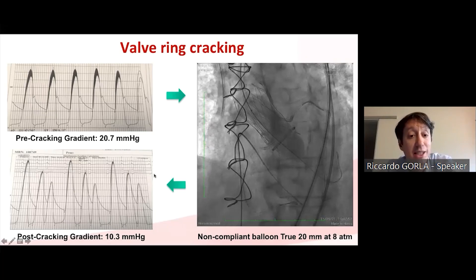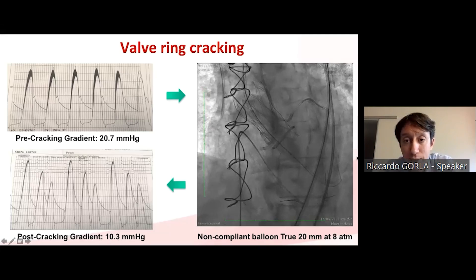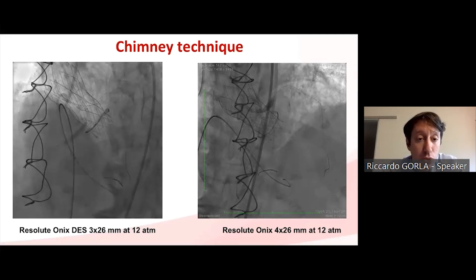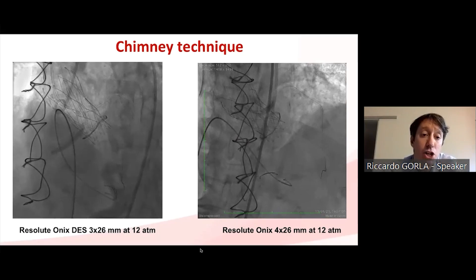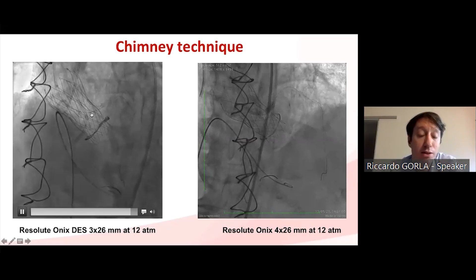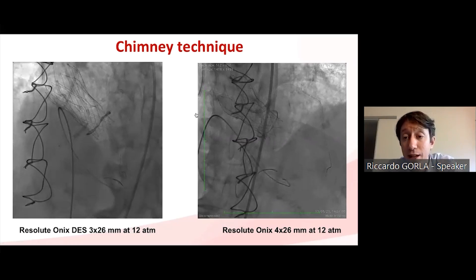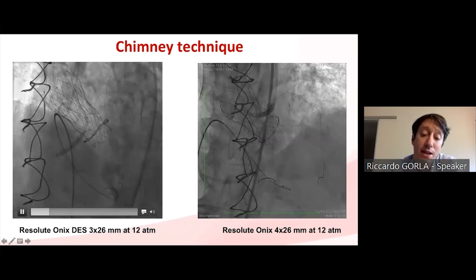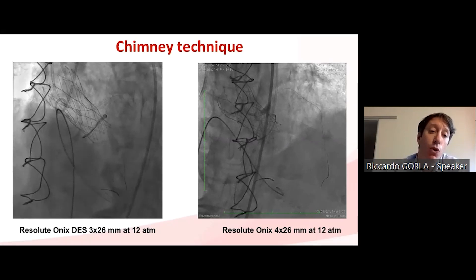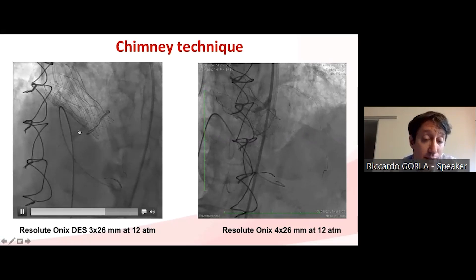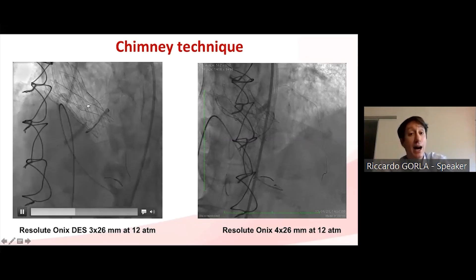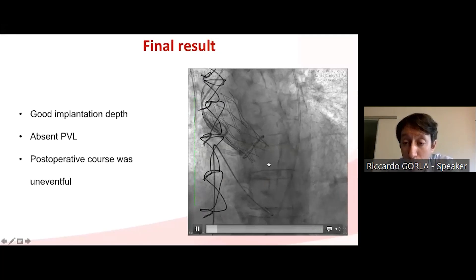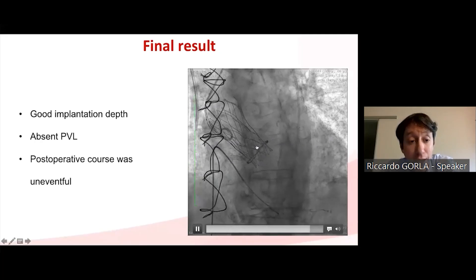The post-cracking gradient was significantly improved compared to pre-cracking. After full post-dilation of the valve, we proceeded to deploy both chimney stents, pulling each stent so that approximately one-third was in the aorta and two-thirds in the coronary artery. During deployment, aim to position the stents as high as possible so the neo-coronary ostia will be higher, reducing the risk of coronary occlusion. The final result shows optimal implantation depth, maintained coronary flow through the chimney technique, and no paravalvular leak.